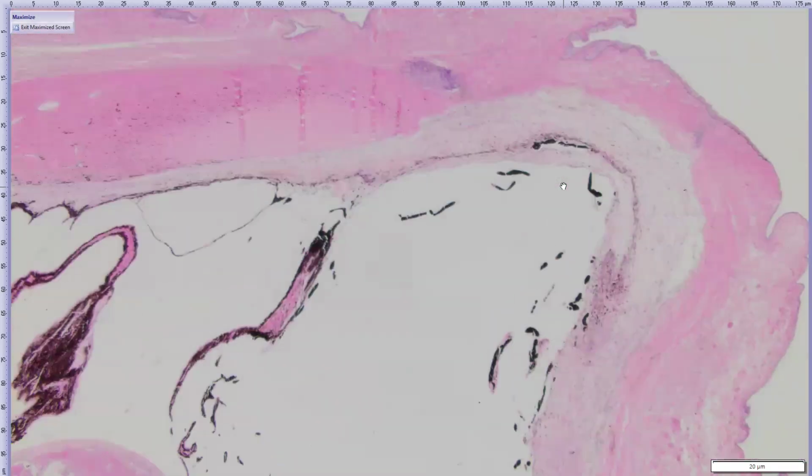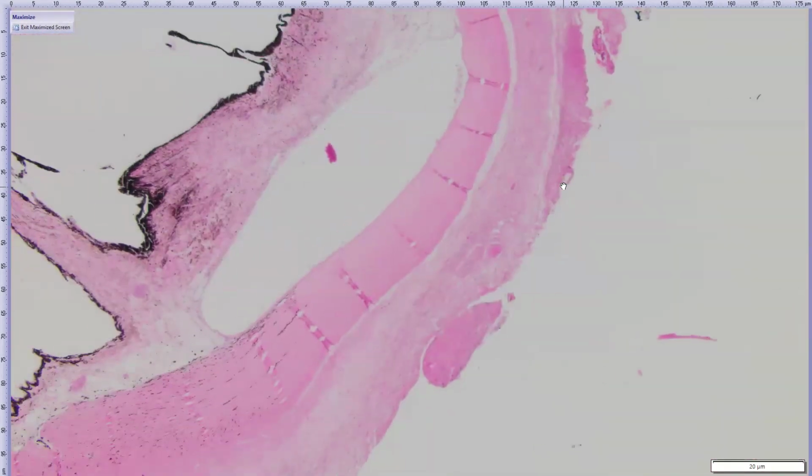All right. So the eye's now been rotated 90 degrees, so the anterior segment is going to be to the right. Our optic nerve will be back here to the left. Let's maybe start with our normal-ish cornea.